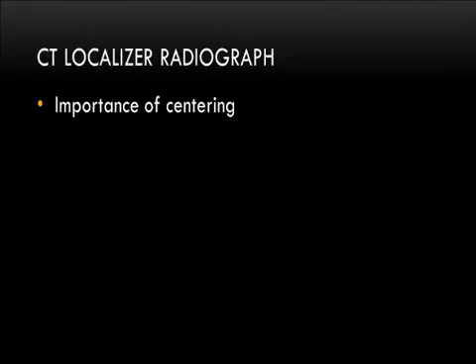I put a placeholder here to say centering is important when you do the CT radiograph. Mark is going to go through that in a little more detail to show you some of the implications if the patient is not centered, either too high in the gantry or too low. That has some implications that are going to trickle down to the automatic exposure control system. So this is just a reminder to pay special attention when Mark talks about that.